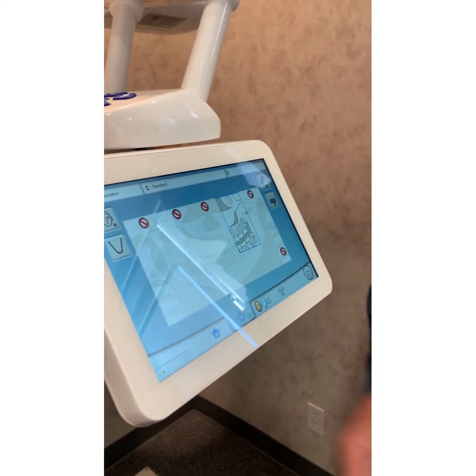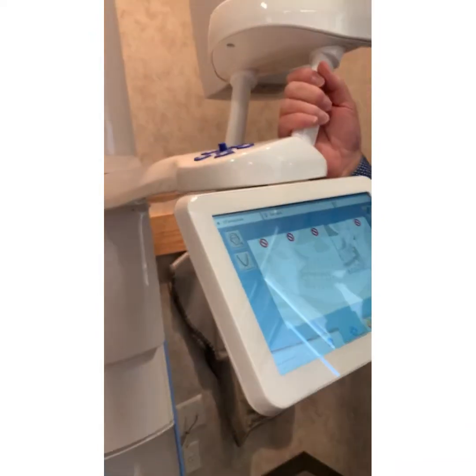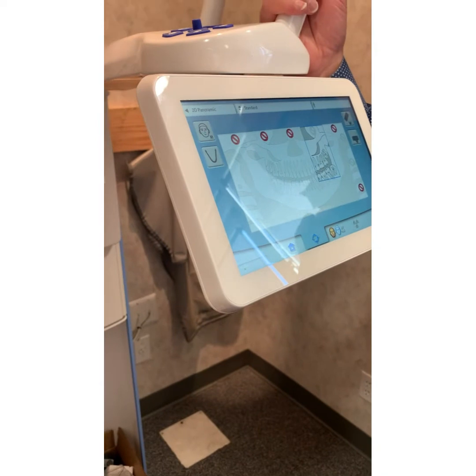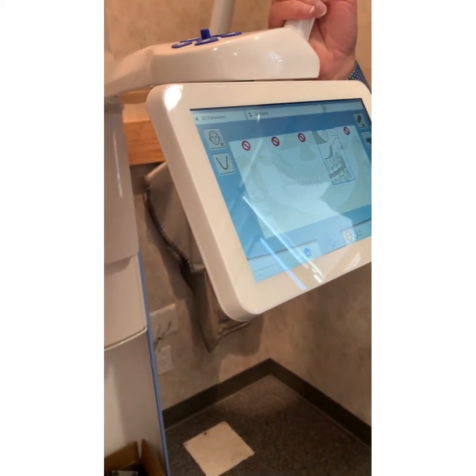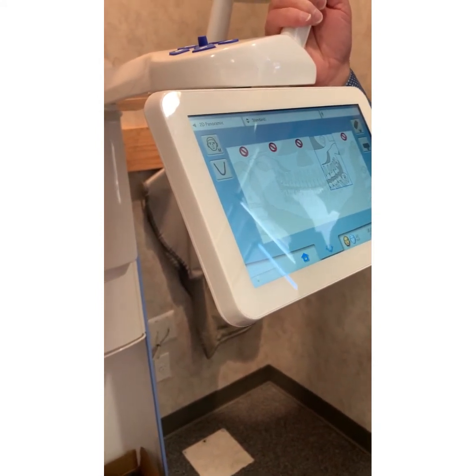The reason I use this is because as a patient, this is my favorite PA to get, right? You all agree? When you're trying to suppress your gag reflex and it's cutting into the back of the roof, as an operator you hate to see the patient wince like that. This is just another way. You'd be surprised at all the anatomy you get when you do this.